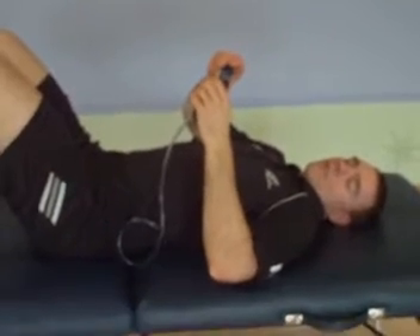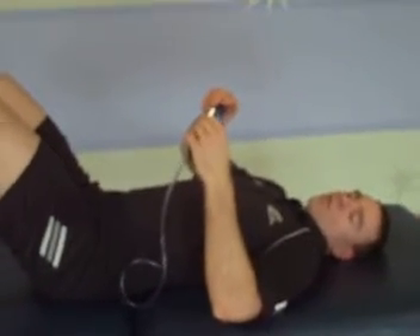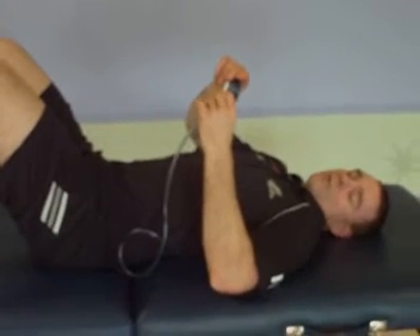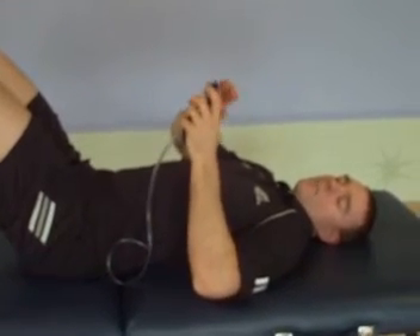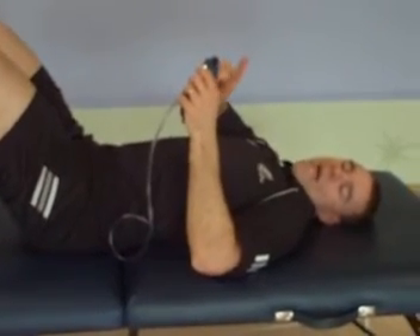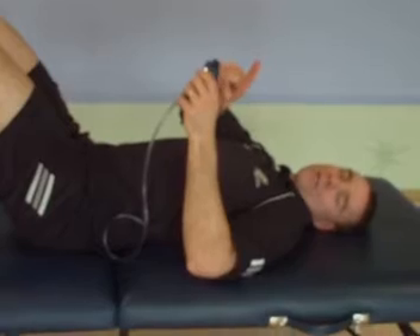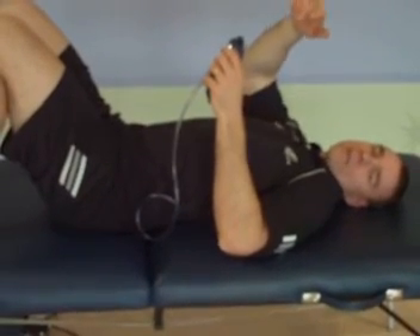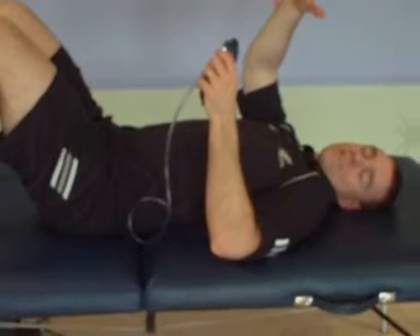So number 60 and then inflate. Once they're at 60, then we're going to have them do the drawing-in maneuver. With the drawing-in maneuver, it will help to bring the meter up to 70. The goal for them is to keep that needle as close as they can to the number 70. It's going to indicate that they're maintaining engagement of the transverse abdominus and that the lumbar spine is staying as still as possible.